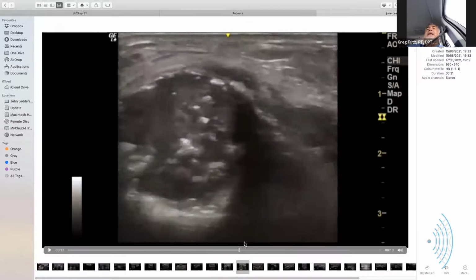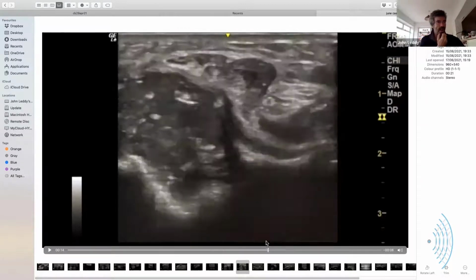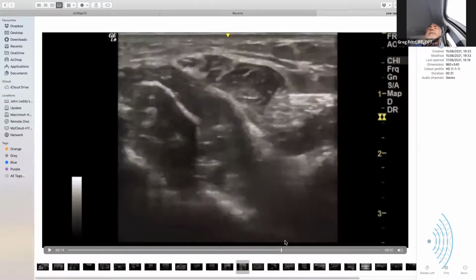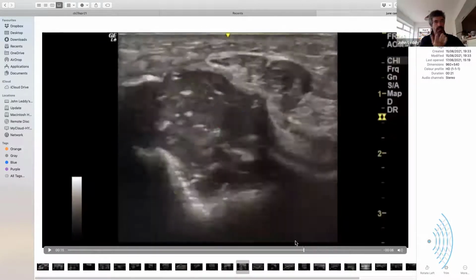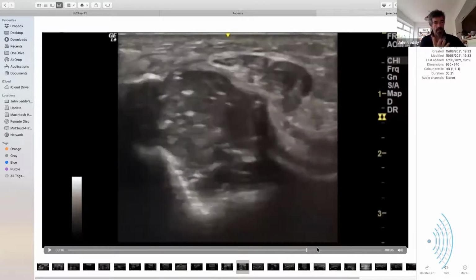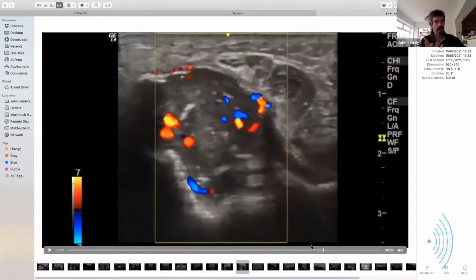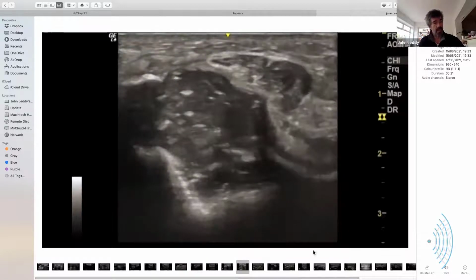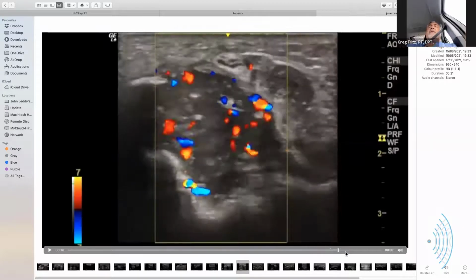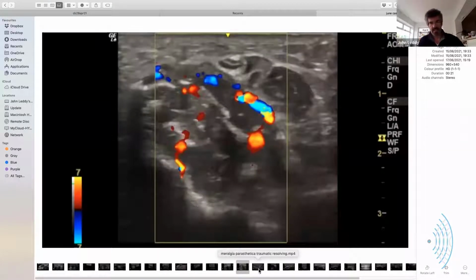That's impressive, man. Well, and that was very active though on color Doppler as well, correct? Yes. But the difficulty my students have, coming from an MSK background, particularly from a physio background, is they don't think about it, and so they're thinking, what's flashing, it's synovitis. Well, no, synovitis is in the joint, it's not in the bone, and you've got to trace that and see it. Wow, that's very valuable, John. That's a metastasis of some sort.